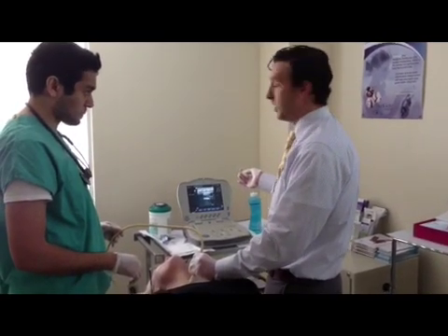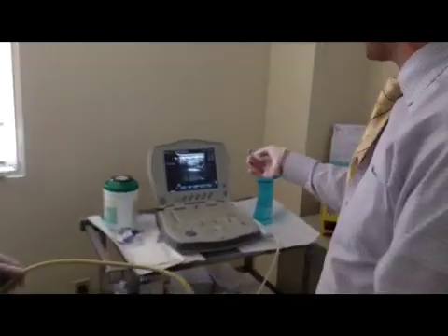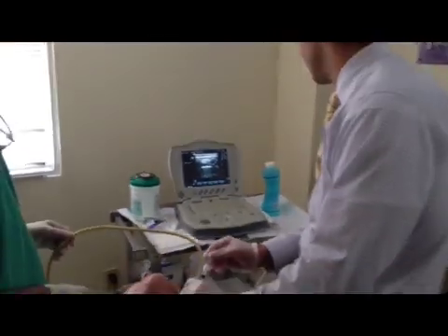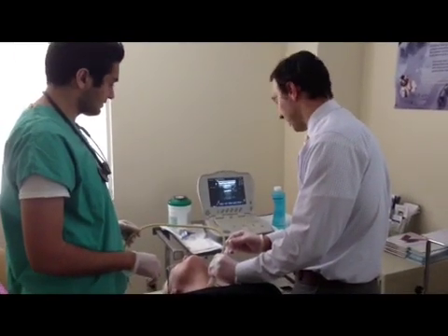As you can see in the ultrasound, you can zoom in on the monitor — you can see the calcified nodule to the right of the screen. The needle is now going to be placed into the nodule for diagnosis.